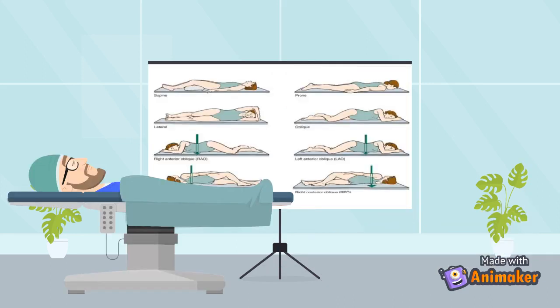There are several positions that a patient can be placed while performing ultrasound examinations. Positioning them correctly will enhance the visualization of the region in which you are focusing your scans. Here are a few of the ones used in ultrasound scanning. A patient laying on their back would be supine. A prone patient is face down on the exam table. Most of the time, we will use a position called left lateral decubitus in cardiac imaging. This refers to a patient lying on their left side, with their right side off the bed towards the ceiling.